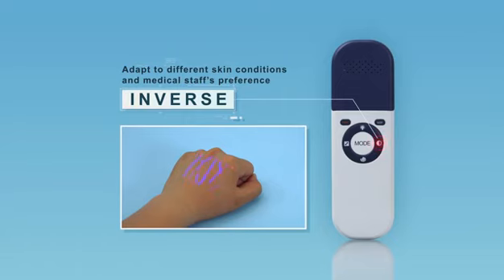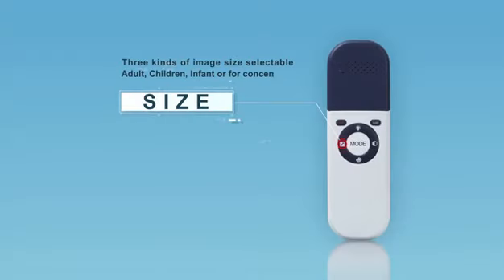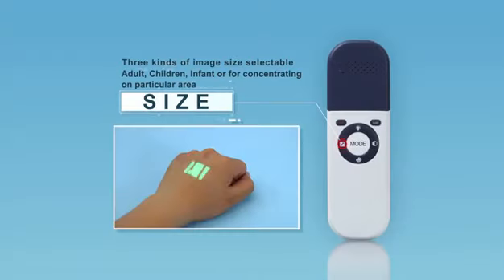Three kinds of image size can suit adult, children, and infant, and are also helpful when medical staff need to concentrate on particular area. Change the size by short pressing the size button.